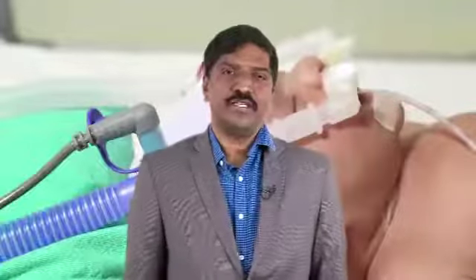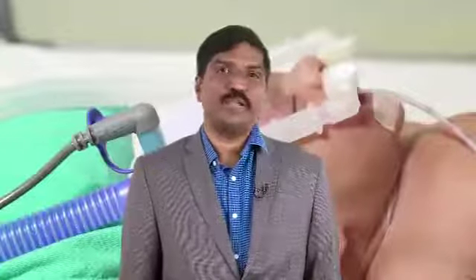Compressed oxygen has 100% fractional oxygen and compressed air has 21% fractional oxygen concentration. A blender mixes the compressed air and compressed oxygen to the desired fractional oxygen concentration ranging from 21 to 100%, depending on the desired FiO2 one sets on the blender.